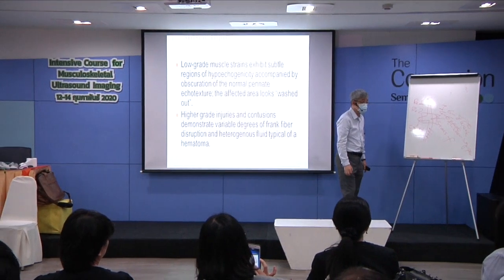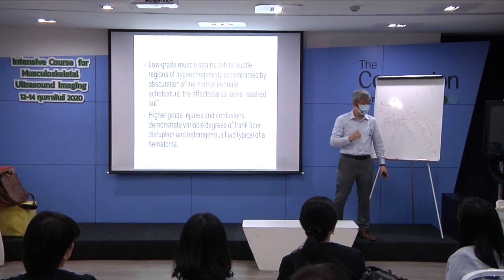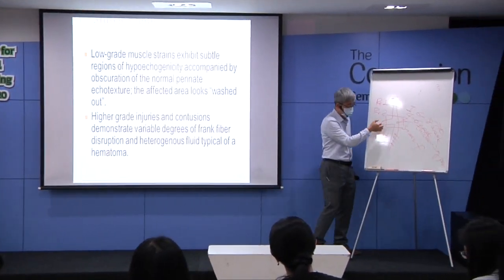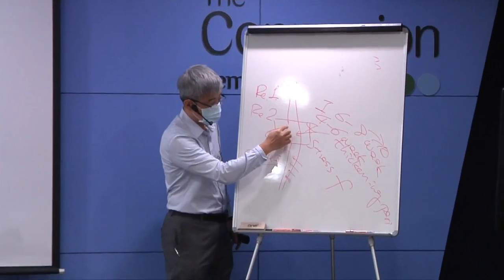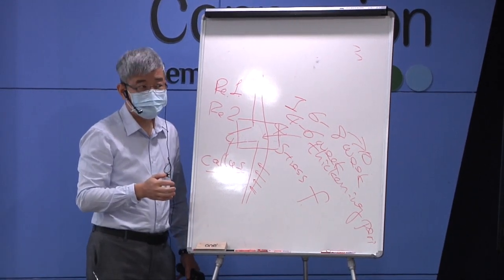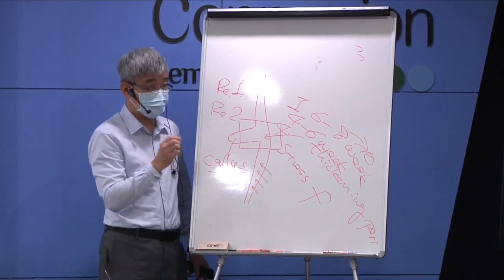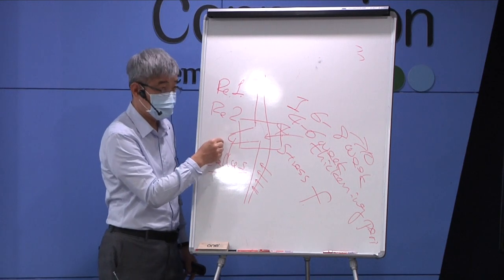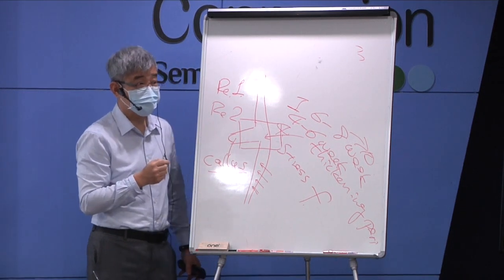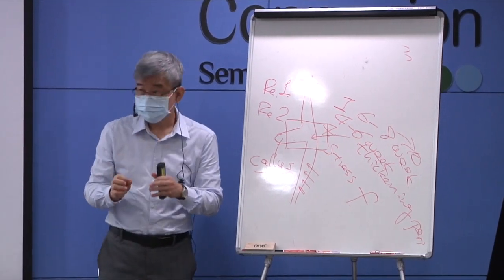Yeah, power. Color will do as well, but if you want higher sensitivity, use power. If the color is not observed for 3 to 4 weeks, then you should check the literature whether or not this kind of fracture is very common with non-union complications. So that's why the scaphoid, we often check scaphoid.